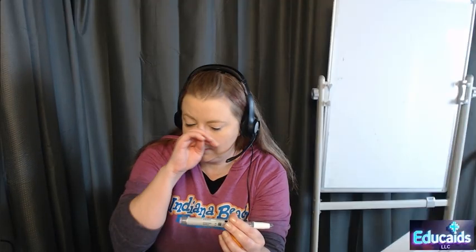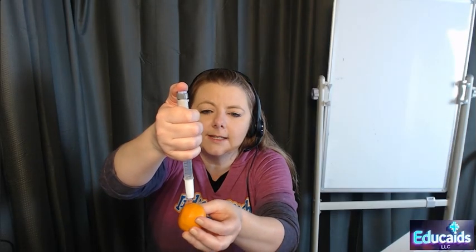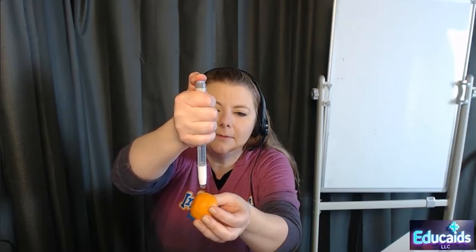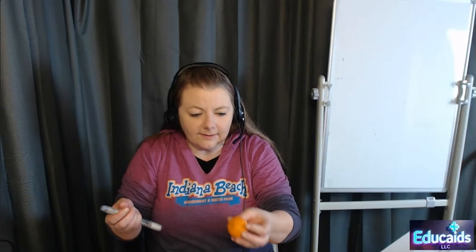Got that primed. And then I'm going to show you what just 4 little units of insulin looks like. 3 banana, 4 banana, 5 banana, 6 banana, 7. There we are. Just that much. Just that tiny little drop. Okay? Like that can really affect our patient quite a bit.